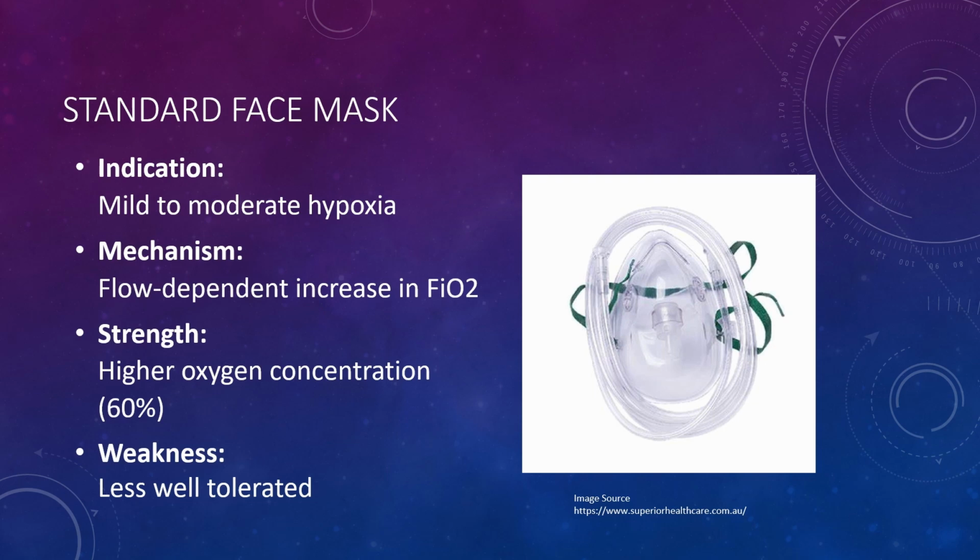However, it is not uncommon for some patients to find masks, of any kind for that matter, are uncomfortable for use. This is a common drawback of this device because patients who are breathless tend to feel a little claustrophobic when we have something sitting over their nose and mouth. But it is a great choice when prongs are not adequate. So let's try this next on our patient and see how he does.